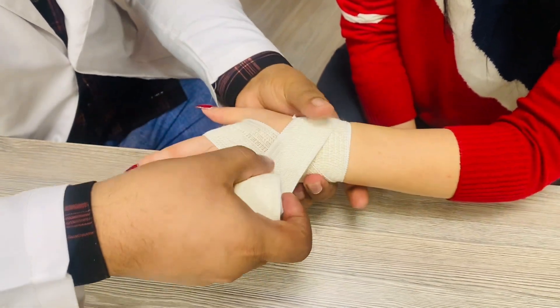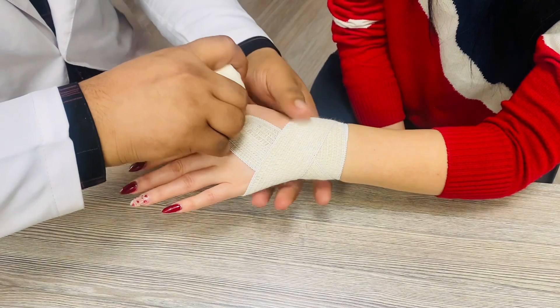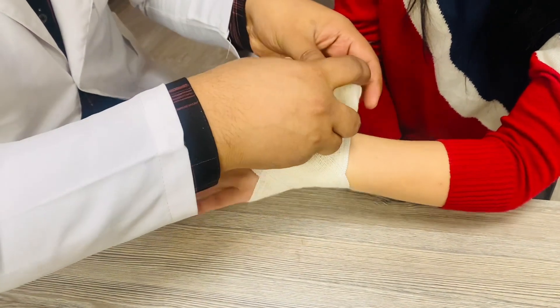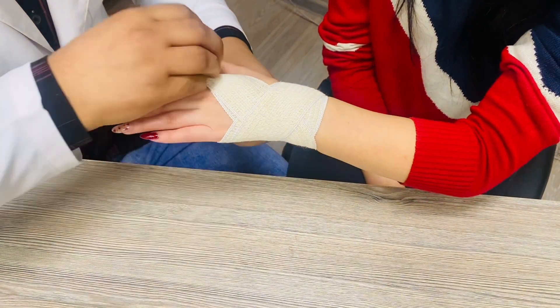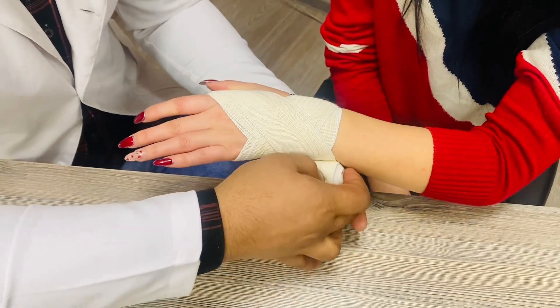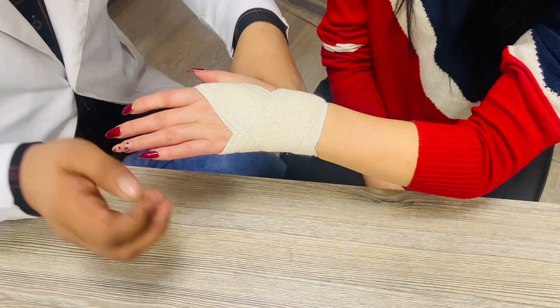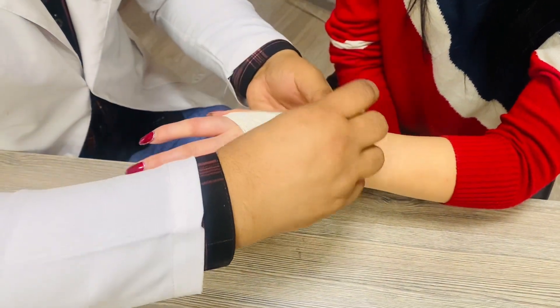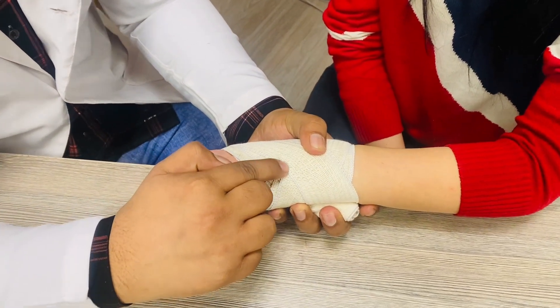So one circulation towards the palm and one circulation towards the palm — repeat this pattern. You are able to see here there is a formation of certain spikes here.